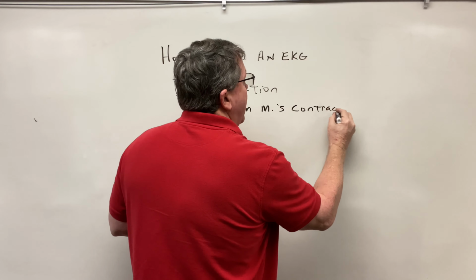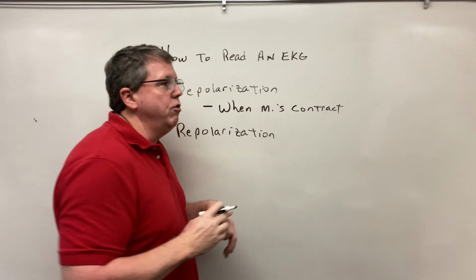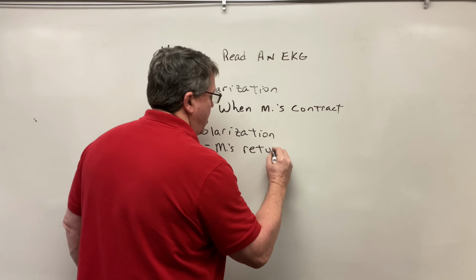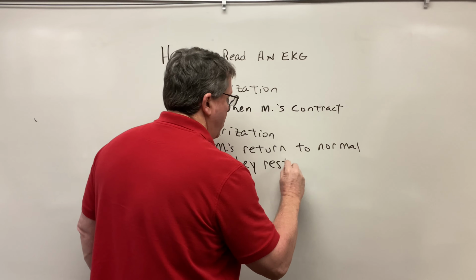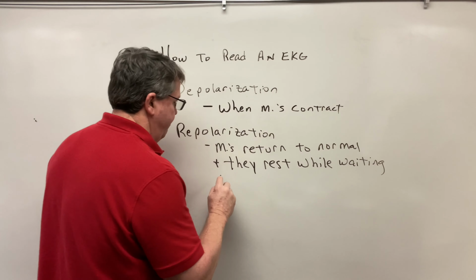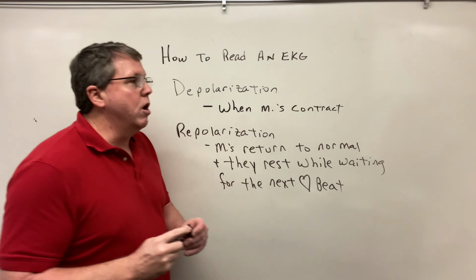And then when we talk about repolarization, what we're going to be talking about is when the muscle returns back to its normal resting position or situation, okay? So in repolarization, the muscles return to normal, right? And they rest, they're relaxing, they rest while waiting for the next heartbeat. And we'll go into this in just a minute. Okay, so those are two terms I want you to know.